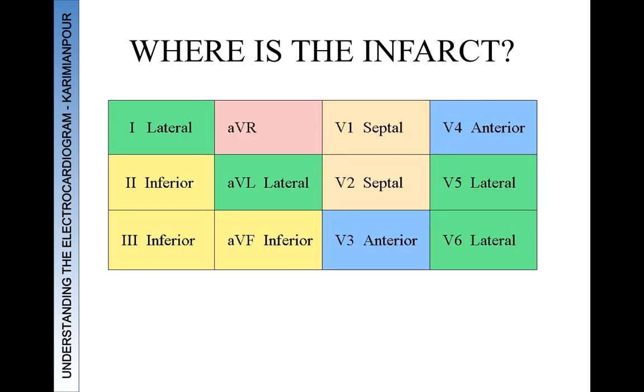So where is the infarct? This is a chart that oftentimes I see people utilizing to try to learn the territories of the vessels.